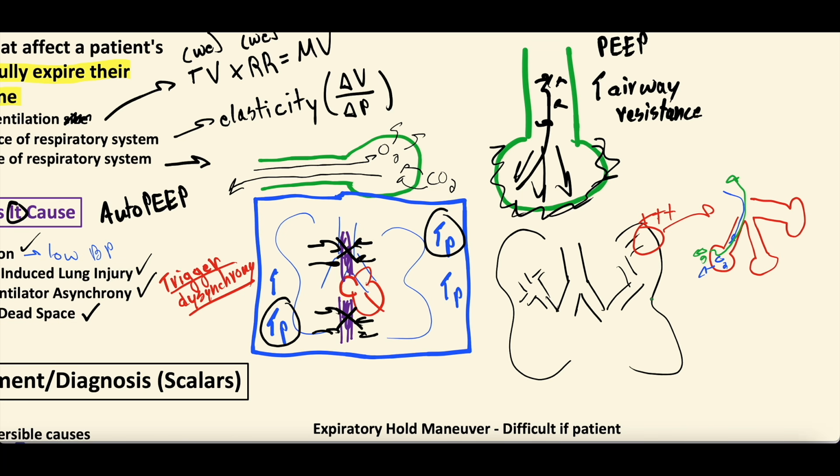So what you can imagine then is there's an amount of air in the system that's not exchanging gas. I'm going to make up numbers here. Let's say that the alveoli, and this is truly a completely made up number, equal 40% of the system. That means 60% of the system is all these airways that are not exchanging gas, and that is dead space.